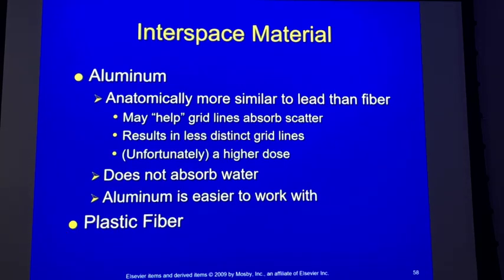The problem with paper is, have you ever dropped paper in water? What happens to it? It falls apart. Kind of gets crumply, right? So imagine you're working a trauma and you shove a grid up under a patient and there's a leak in the covering of the grid and it gets down inside of the grid. If the interspace material is paper, you're going to have a messed up grid, right?